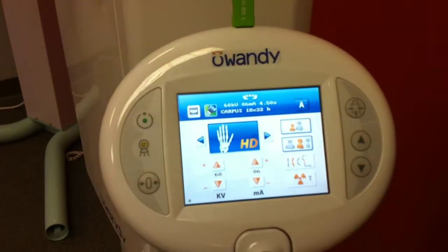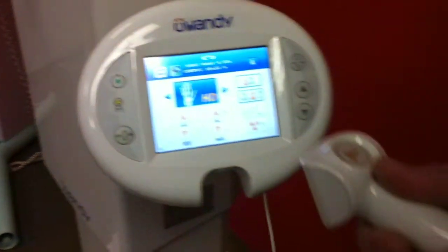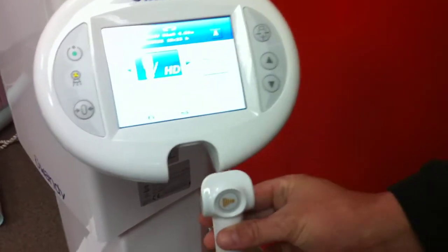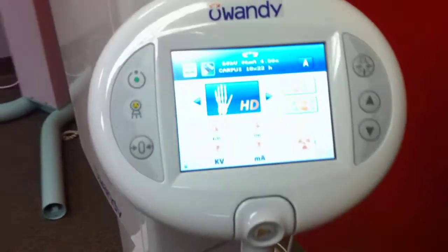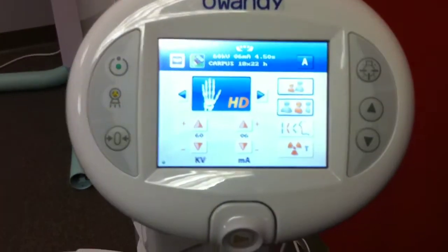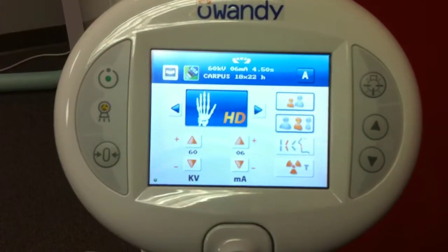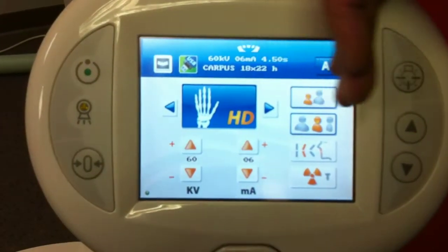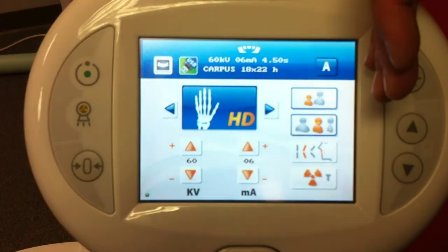This is the switch you use to activate the machine and take your image. It's magnetic and easily goes back into place. And when you're done with your image, you can actually see it as it's being acquired on the screen here.